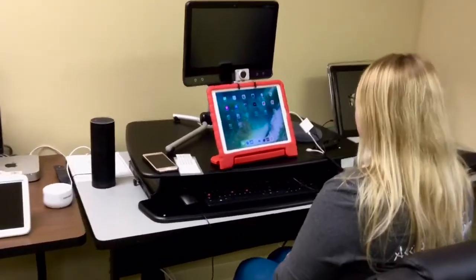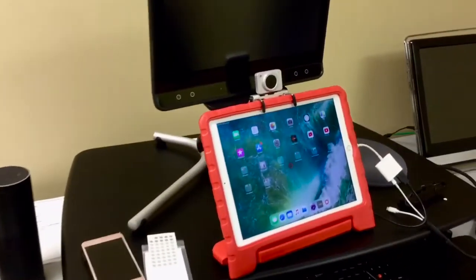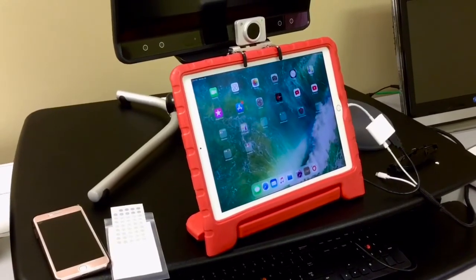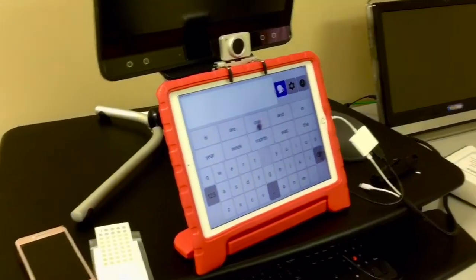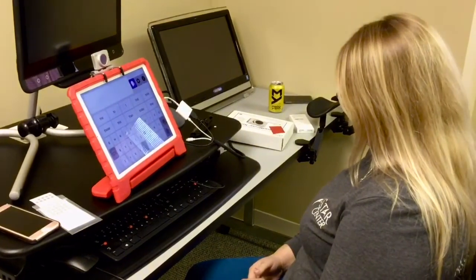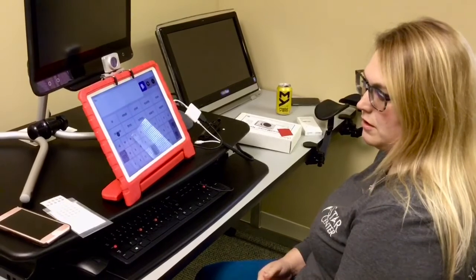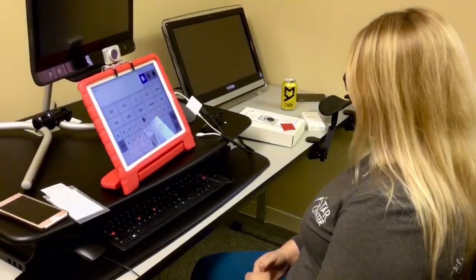So, as you can see, it comes up with a cursor that is checking on your timing. We go into the communications folder. So now we're in. It'll do prediction. You can choose.